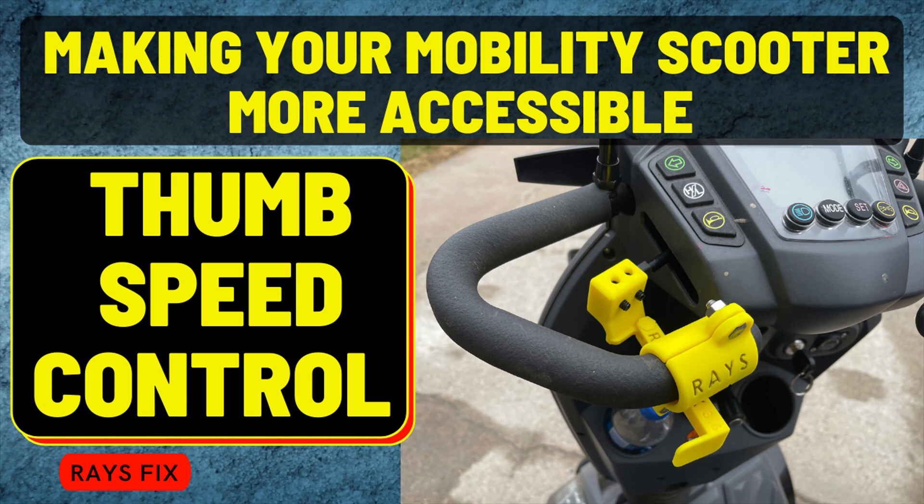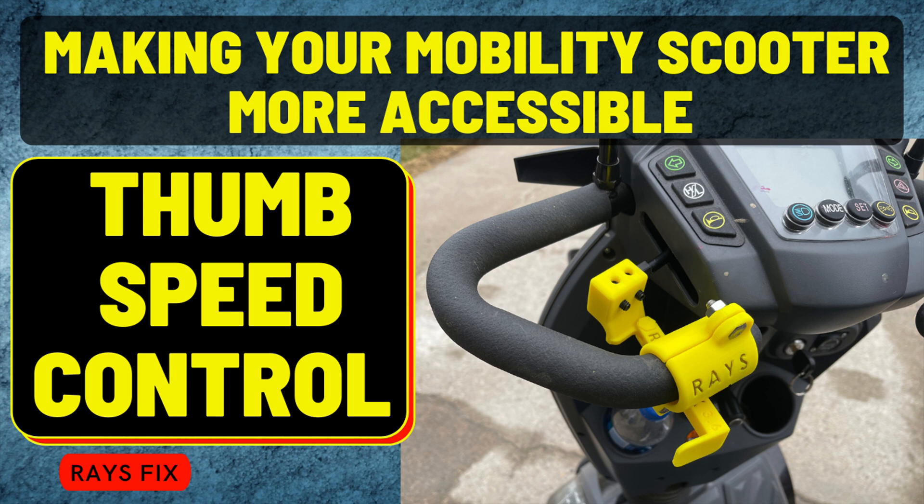I'm making this thumb speed control to make my mobility scooter more accessible. The reason is because my father had a stroke and he only has ability in one hand. Also, this machine is extremely fast and he would not be able to handle it at high speeds.